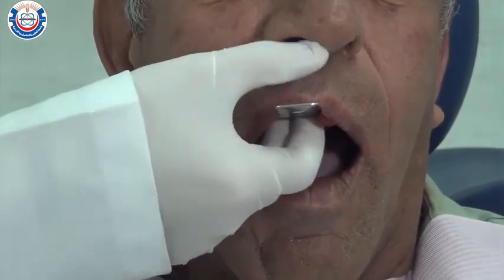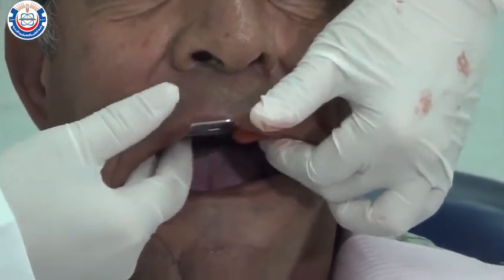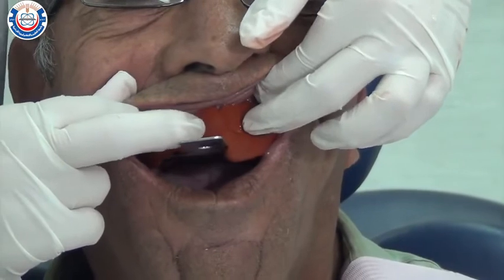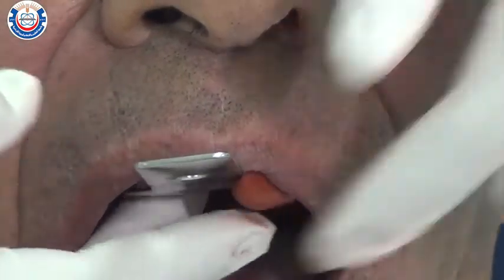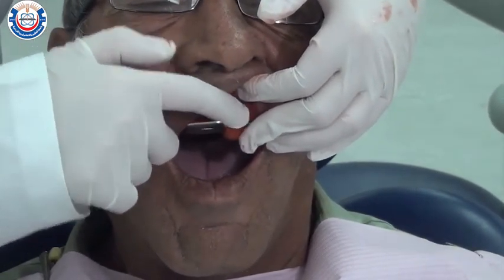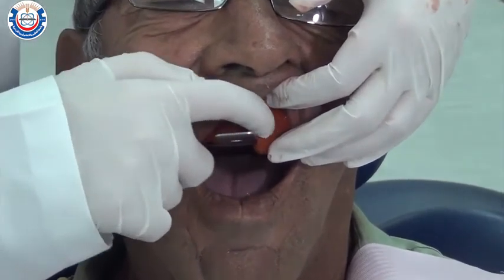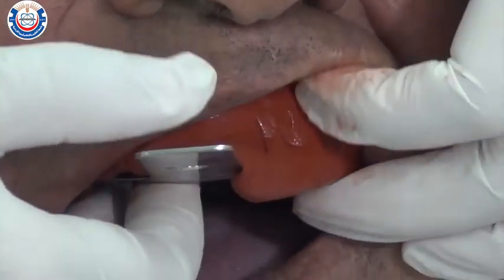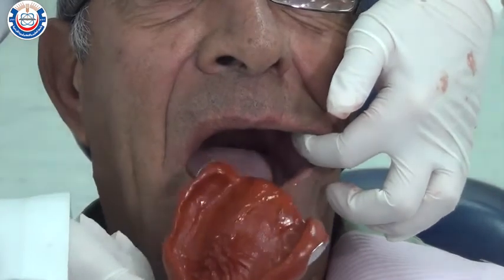Keep firm finger pressure on the tray while waiting for the material to complete its set. Notice that if the material is not completely cooled, you can see imprints of your fingernails on the impression. Once you can no longer see these marks, the impression is ready to be removed. Once the material has cooled down to mouth temperature, gently break the seal around the impression from the posterior by allowing air under the sulcus, rotate it downwards, and remove it from the patient's mouth.